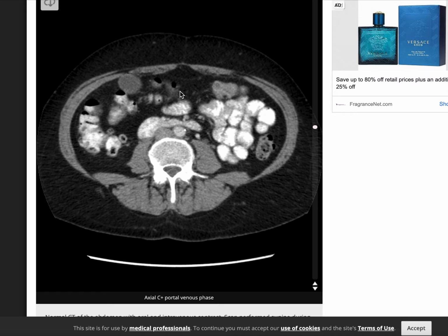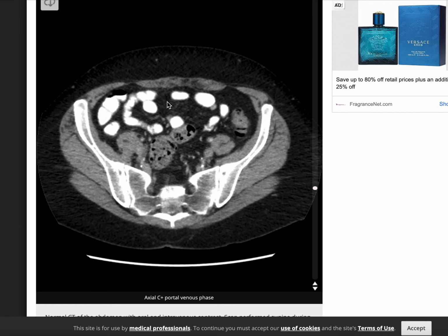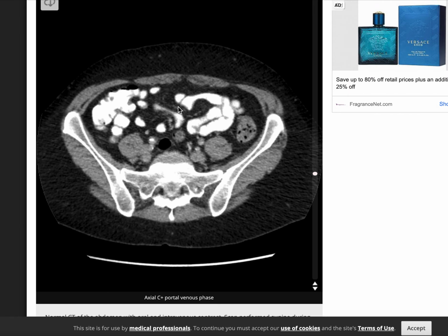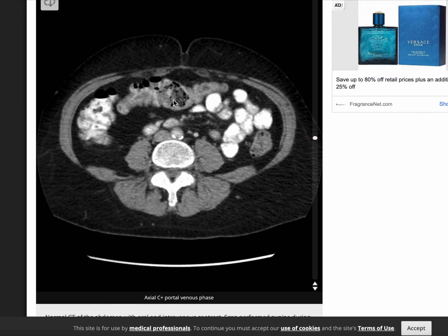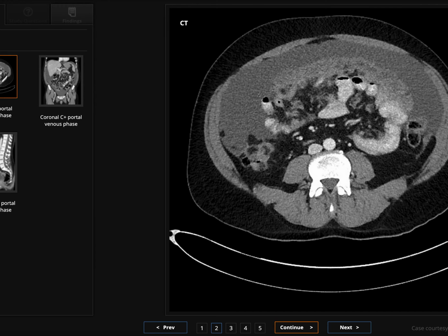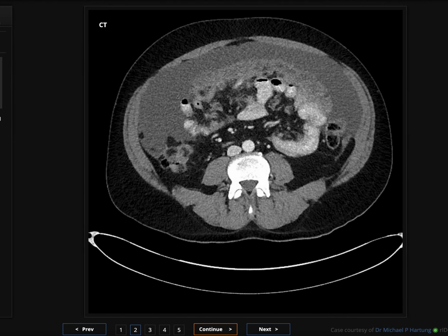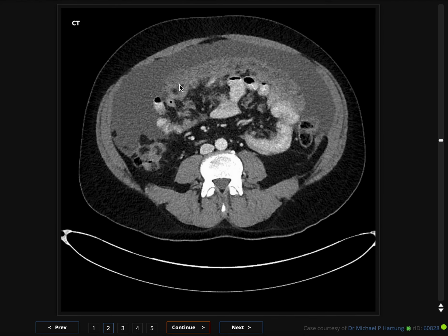See, when I scroll down, the fat in the mesentery and the omentum should just be nice and dark. I mean, some blood vessels here and there, but otherwise it should be pretty nice and dark. If we compare that to our current case, right here, you can immediately see that this is way too dense, and this is not from blood vessels. You can imagine, okay, is the ascites causing a little bit of inflammation? It could be, but this is way too thick.